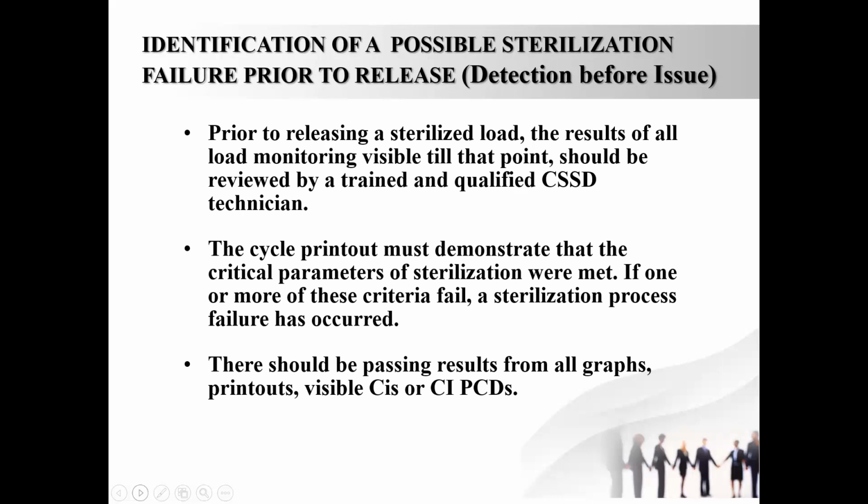The printout must demonstrate that the critical parameters of sterilization were met. If any of these parameters fail, then a sterilization failure has occurred. So all passing results are required from graphs, printout, and visible chemical indicators.